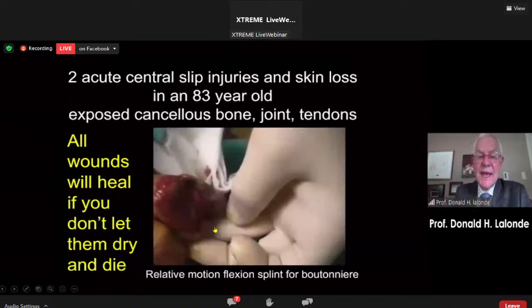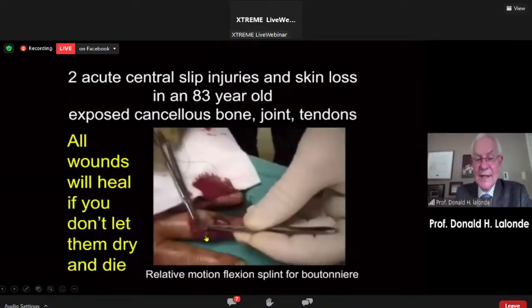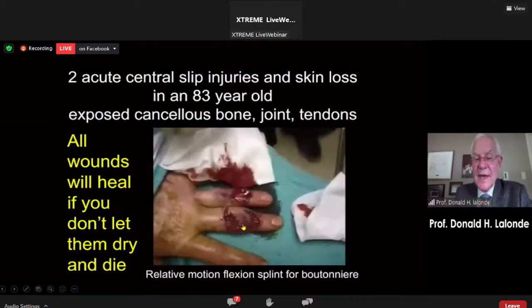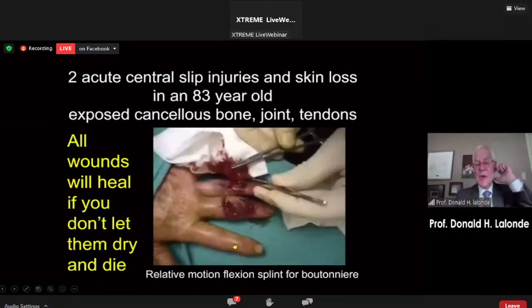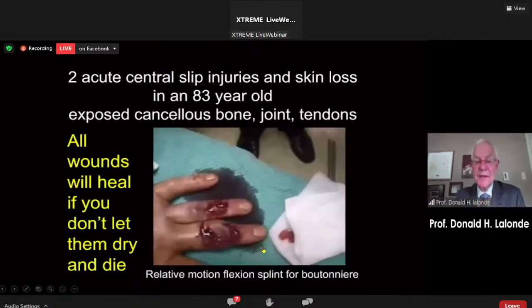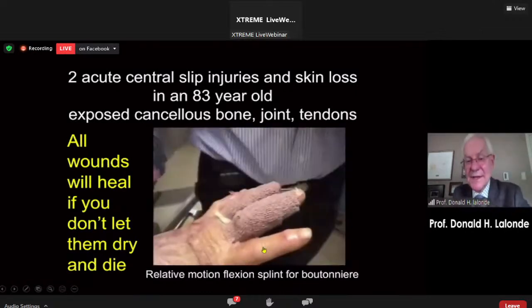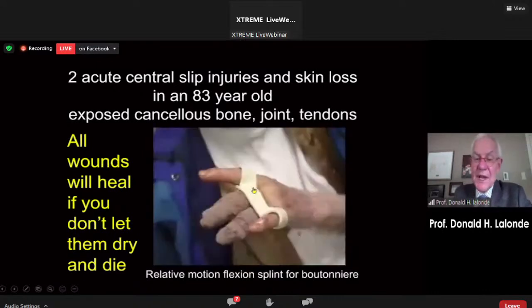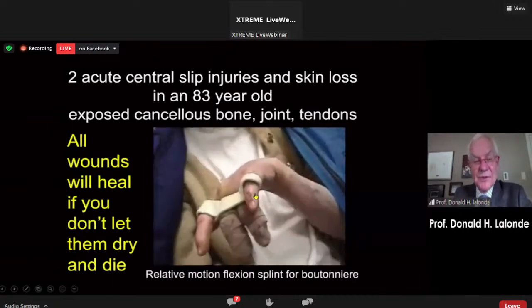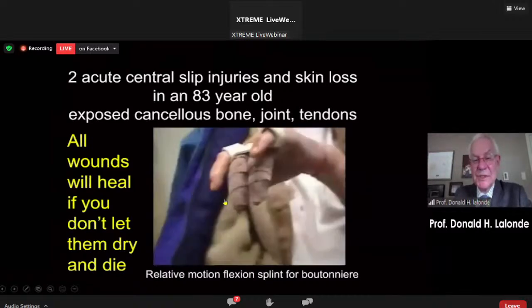So she still has not yet developed a boutonniere. And you can see that she can extend her PIP. So we just tack what's left of the skin back. That's the only surgery she had in a minor procedure room, never went to the OR. And then we put Vaseline and Coban. And if you put Vaseline and Coban tape, bones will heal, joints will heal, tendons will heal. You do not need flaps on these. And the relative motion flexion splint solved her boutonniere problem. And that's a whole other lecture all by itself, how to solve boutonniere problems with relative motion flexion splints.